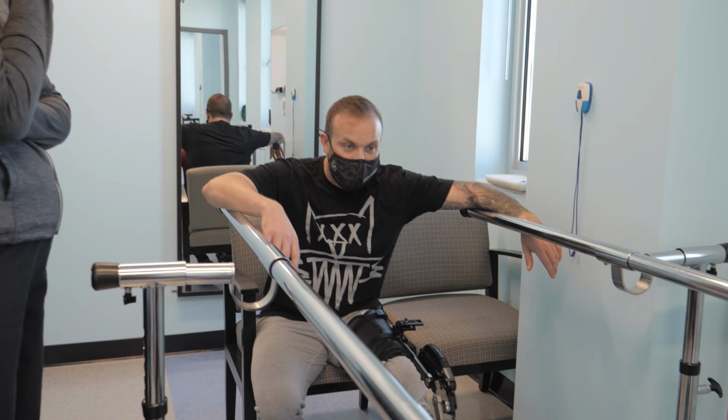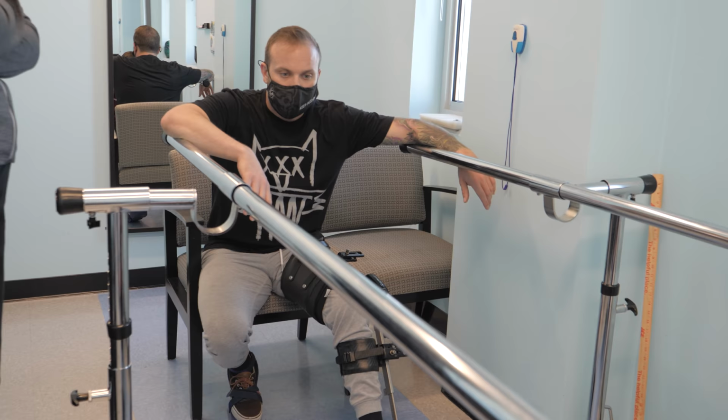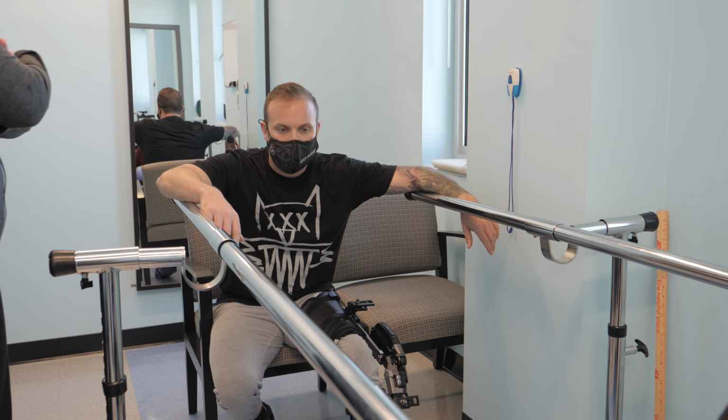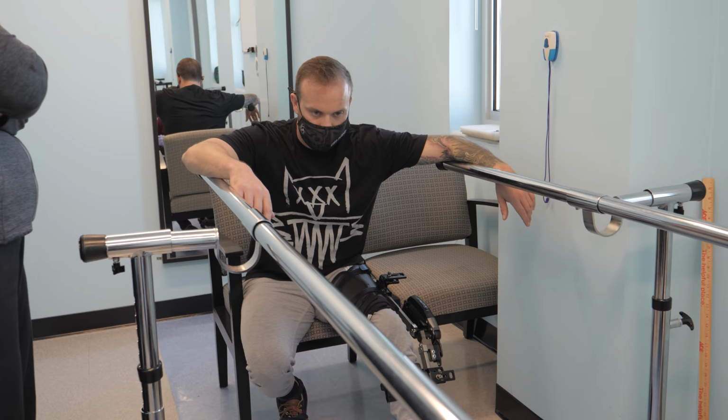You could try stairs or ramps if you wanted, but you passed the trial. So the question you have to ask yourself is, is it giving you the speed you want, the symmetry of gait? Is it giving you the support you desire? And then uneven terrain. So as far as the mechanical part of that test, you've done great.